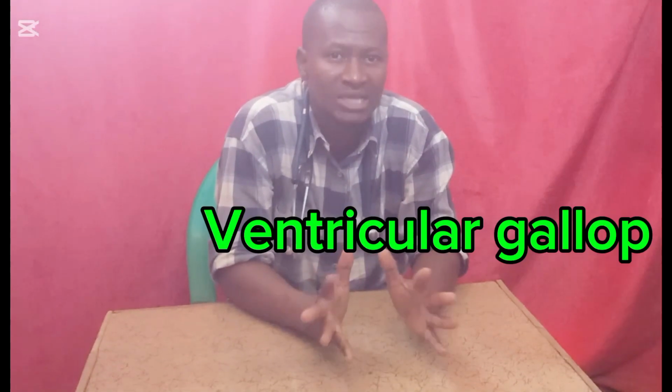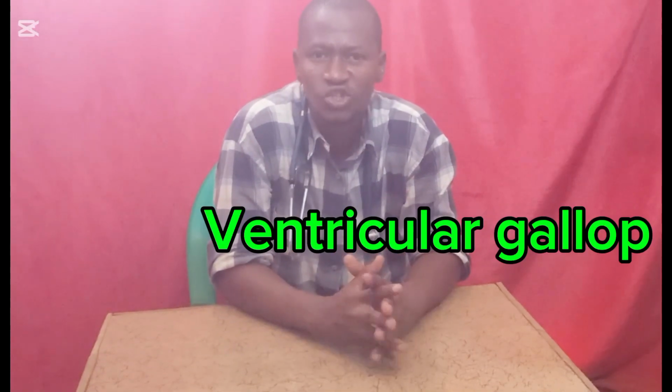We also have the extra heart sounds, that is the S3 sound and the S4 sound. The third heart sound occurs during ventricular filling, which is also known as ventricular gallop. It occurs generally in young adults and children, at the age of 40 or under. It can be normal or pathologic.